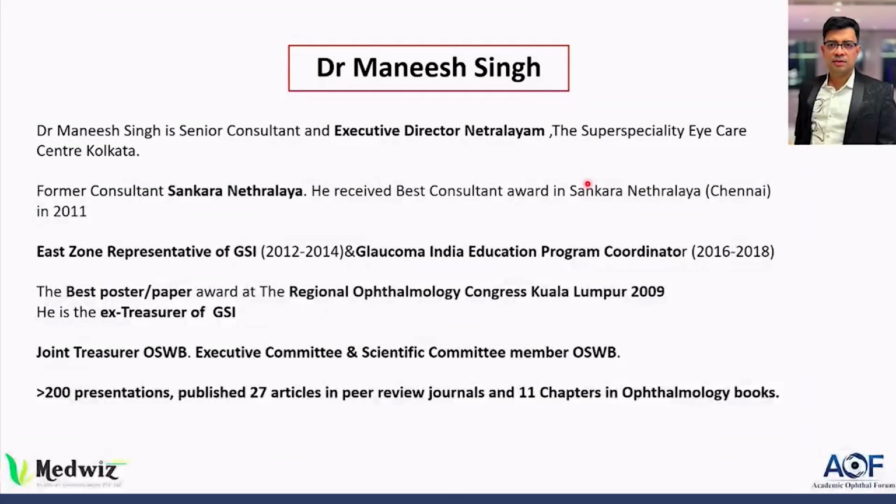Fallacies of OCT. So a tool that all of us are using, but any tool is going to have a role and it's going to have some fallacies. So over to you, Manish.